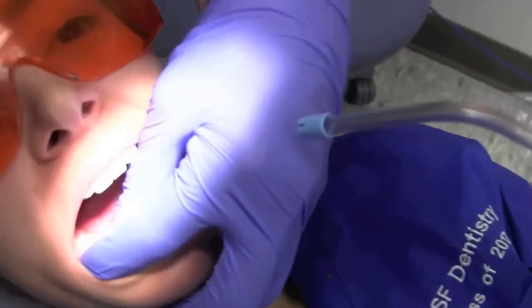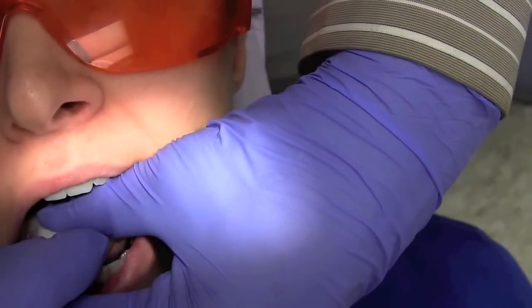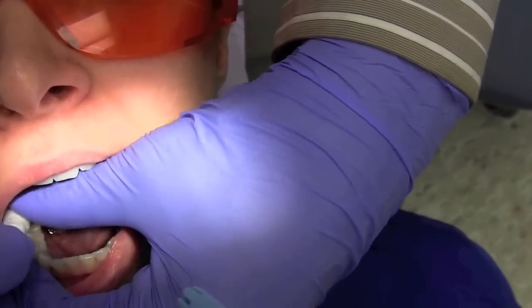Okay, so that was our full minute. We're going to come back here. We're going to use the cotton that we used to isolate to soak up any excess silver fluoride in the area.